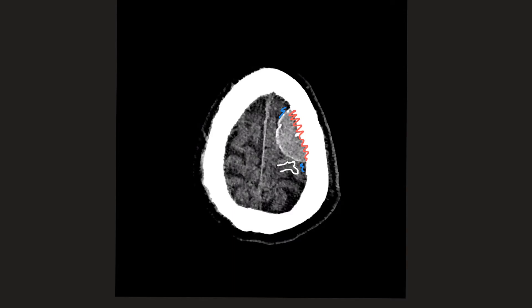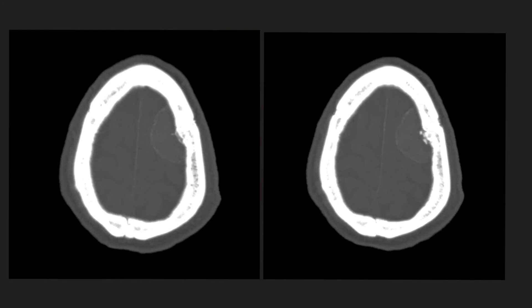Let's take a look at the bony windows. You can also see that the adjacent bone is hypertrophied and expanded, in keeping with bone hyperostosis. So overall, this lesion, which is partially calcified, has a broad dural base, has a CSF cleft, and has bony hyperostosis. This is in keeping with a large meningioma. It's probably been there for a while, but there is some brain oedema, and this will require a referral to the neurosurgical team.